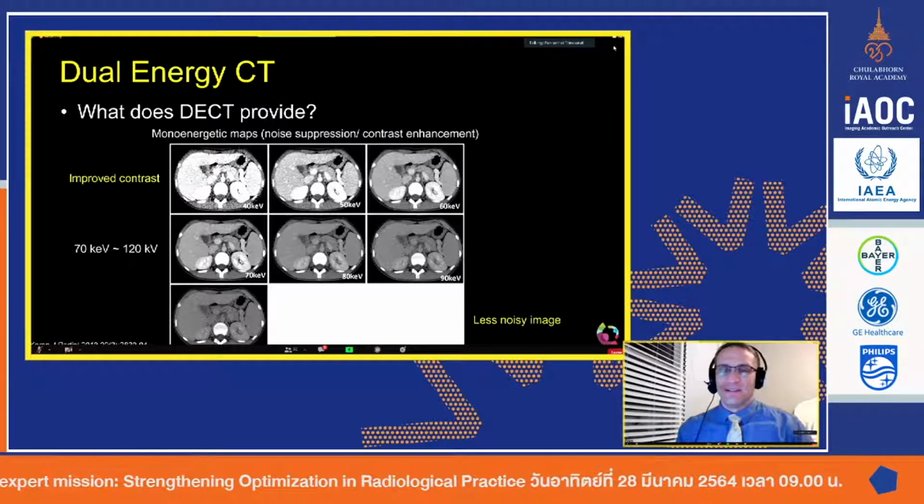I think that in the case that we cannot get the intravenous access, that is very good, and like a slow flow injection or something. Yeah. Yep. But to be honest, here in the US, we do not do a lot of dual energy in kids. We just don't. And we're still looking for that. The doctors and hospitals are still looking for that clinical indication that makes a lot of sense for dual energy. So hopefully we'll get there one day.